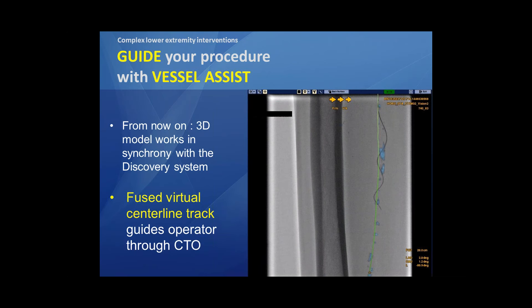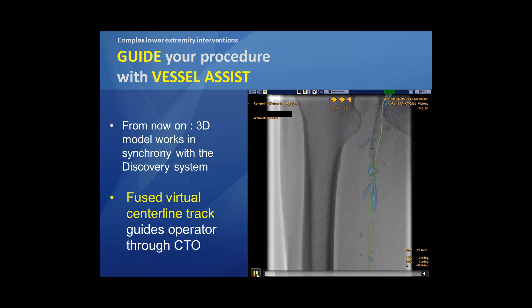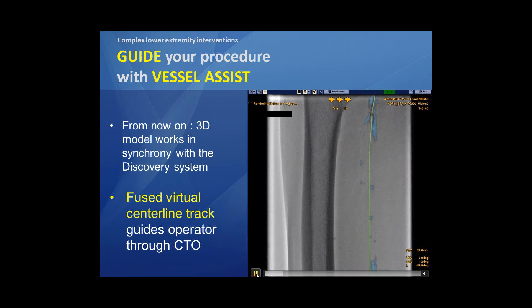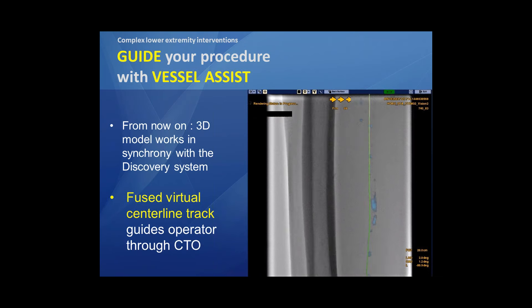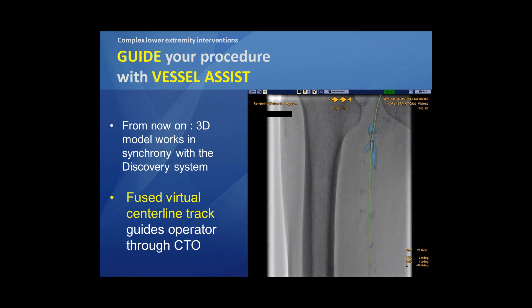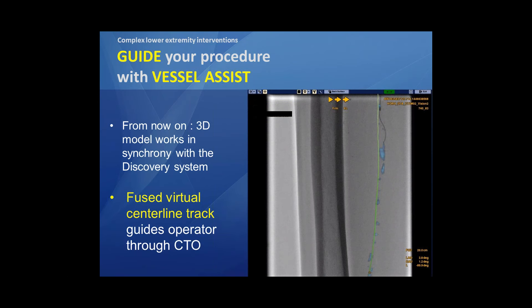As you can see here, we have this centerline tracking that we prepared in advance fused into our live operating image. I can really use it to guide me through the difficult occlusion. I'm guided by the blue sub-volume, the blue calcifications extraction, in order to avoid false routes, avoid perforations and collaterals, and so on.